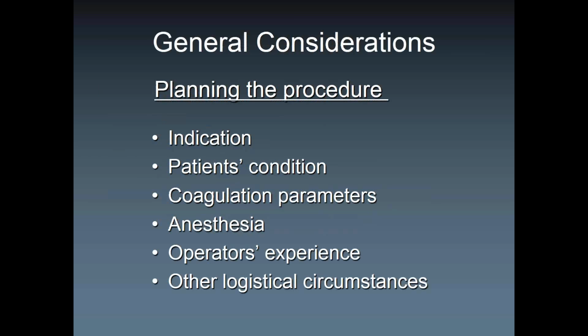The most important thing is to have a plan when you see a lesion on a modality. If it's CT, MR, PET, or ultrasound, you have to plan the approach. And to do that, you also have to check if the indication is right, because sometimes the approach is so tricky or dangerous, it might not be worth it, or it's really not worth the risk at least, right? You have to take a look into what the patient is overall like.